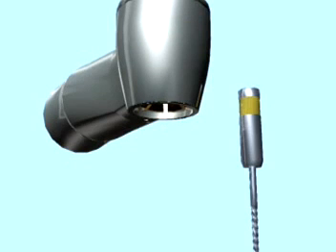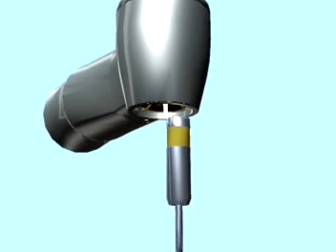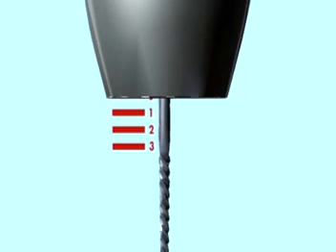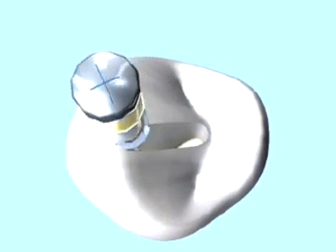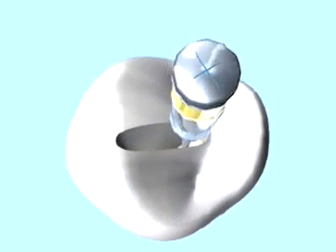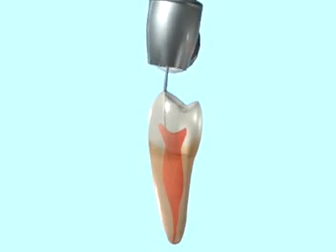The files can be inserted into the Endoese handpiece to different lengths, making it so that it's not necessary to use a stop. This handpiece has a 30-degree reciprocation, and the action which is used is an in-and-out, back-and-forth milling or painting motion, getting all the walls of the canal, following the contours of the canal.